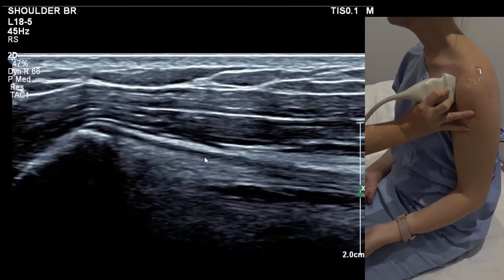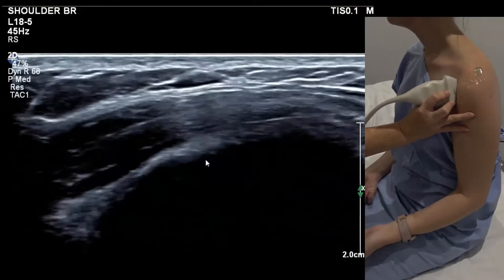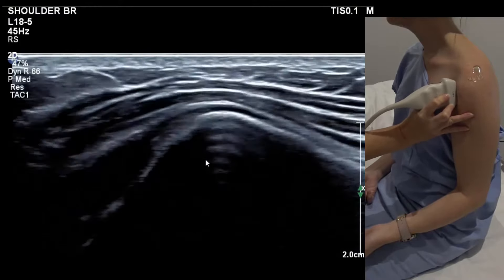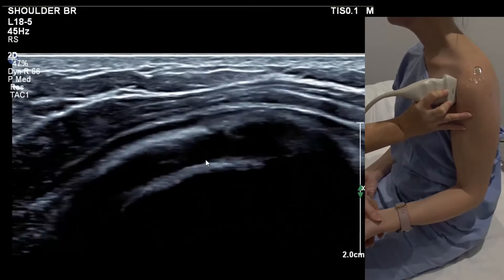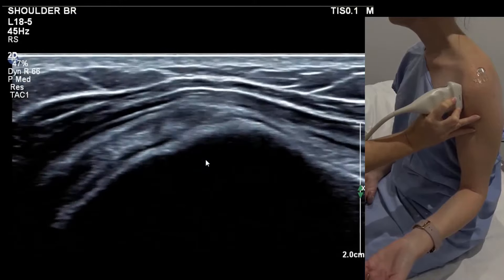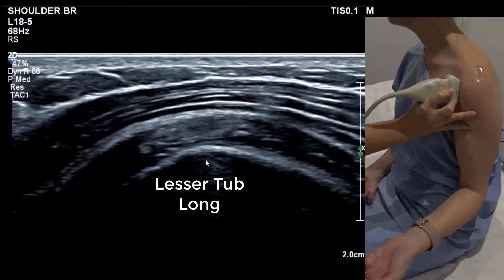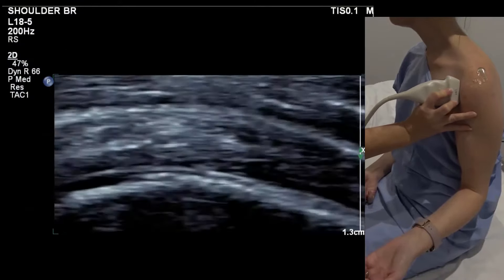Now we line up on that and slide back out laterally, and we fall onto subscapularis in transverse. Subscapularis in transverse is a slightly difficult one because it's a multi-pinnate tendon, so it never quite looks very uniform.